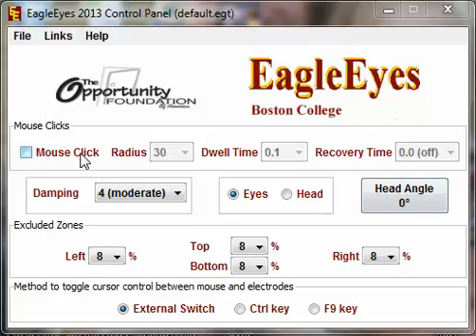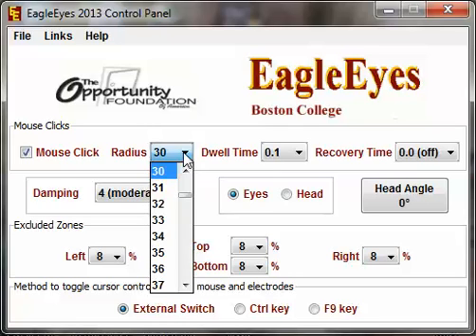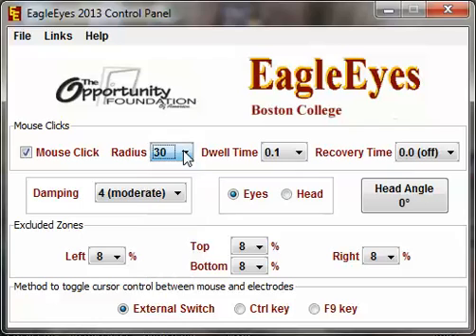Into the settings — we have the mouse click settings at the top. You can turn that on or off. The mouse click creates a single mouse click; it cannot do double click or click and drag. To create a single mouse click, we have some variables to set. The radius is the area in which the user needs to focus in order to create a click, measured in pixels. 100 pixels is one inch on a normal computer screen, so with 30 pixels they have to focus within a 30-pixel area to create a click.